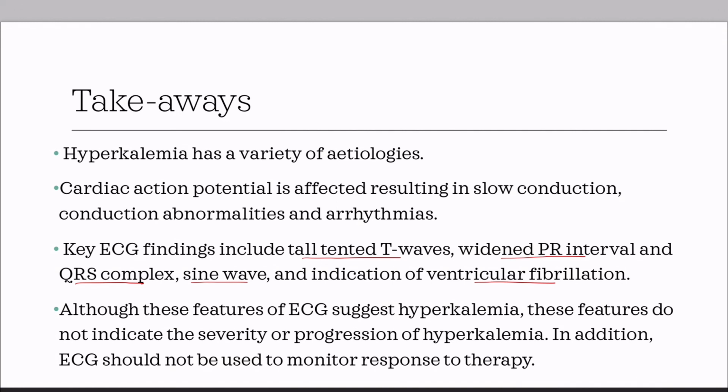So I want to make this important point here again, which is that these ECG features suggest hyperkalemia, but they don't indicate the severity or progression of the condition. In addition, ECG should not be used to monitor response to therapy. Okay, so that concludes our tutorial on hyperkalemia.